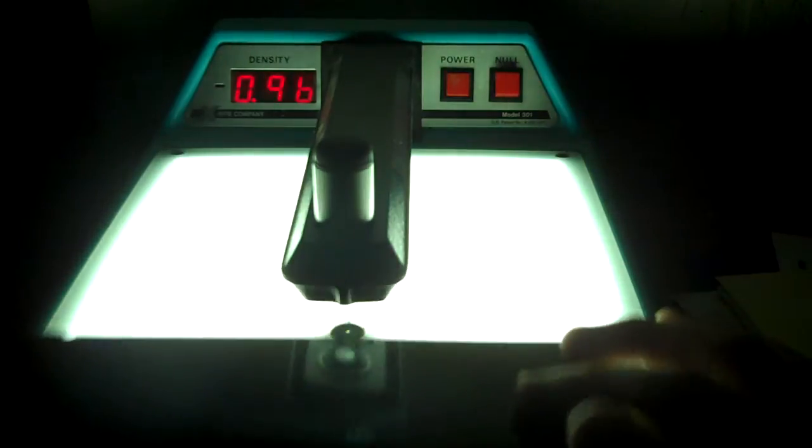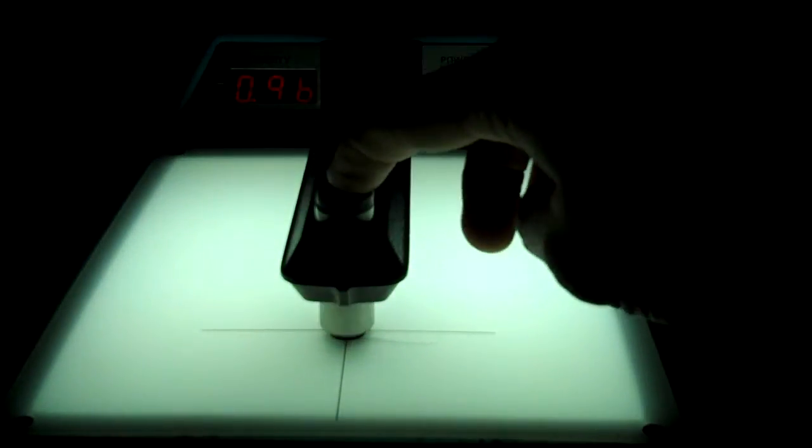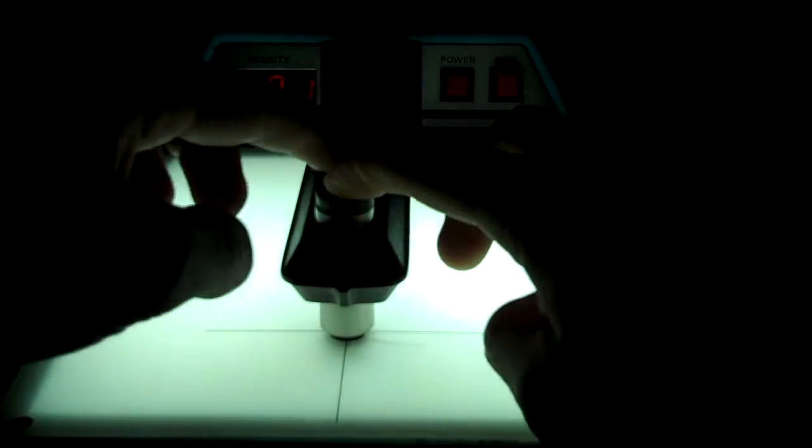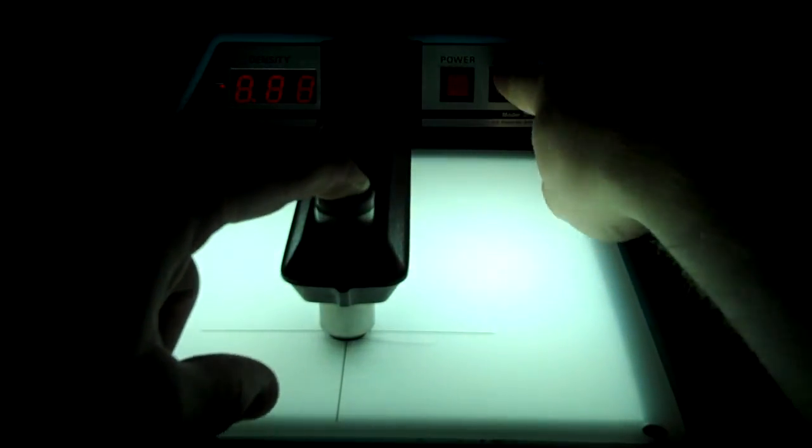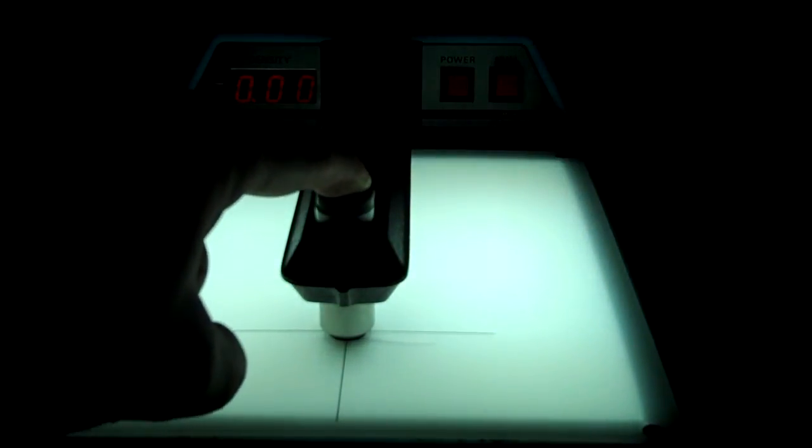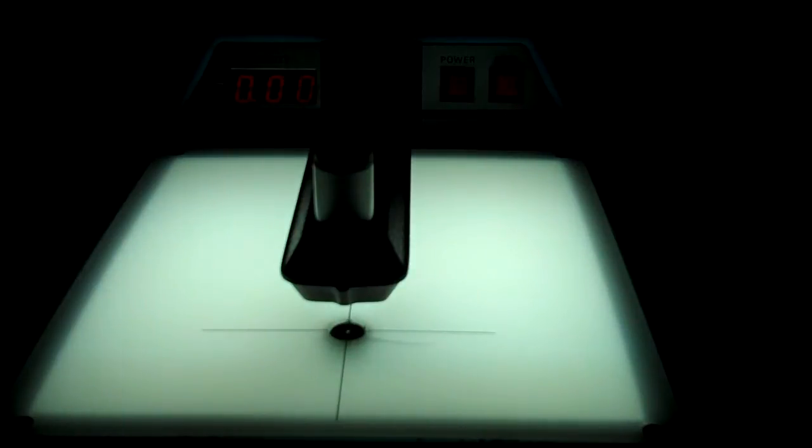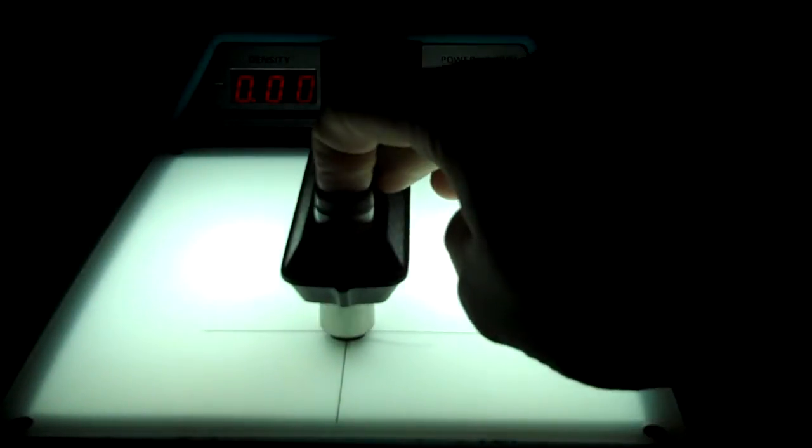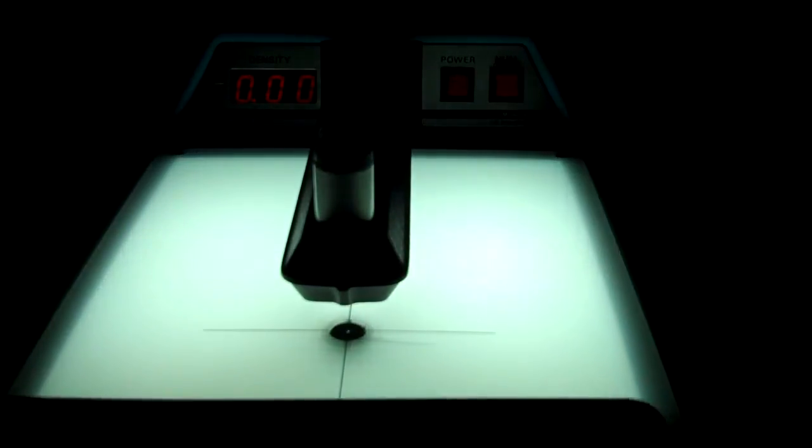So now we actually want to take a density here. We're on the densitometer. You can see back there it says 0.96, now it's 0.01. We're going to null that out. This is how you'd operate this densitometer. You'd warm it up, let it come on. We null it out and we hit this button here a couple times to make sure.